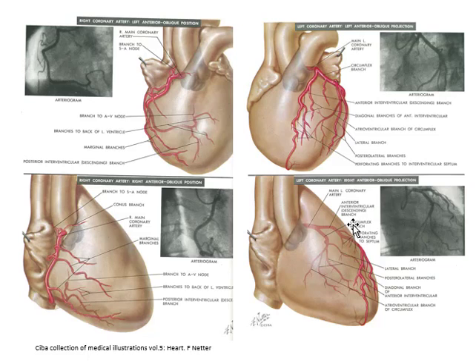Whereas in the RAO, the circumflex has been more separated from the LAD and the LAD has been forced to the right. The heart itself has sort of rotated in the RAO. We'll try to relate these anatomical details to identification of these coronary arteries with our angiography.